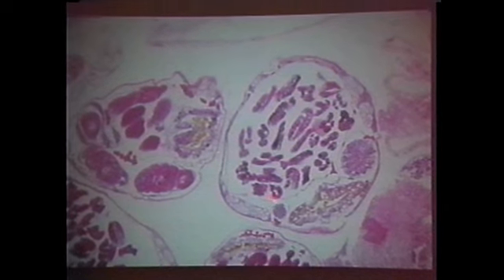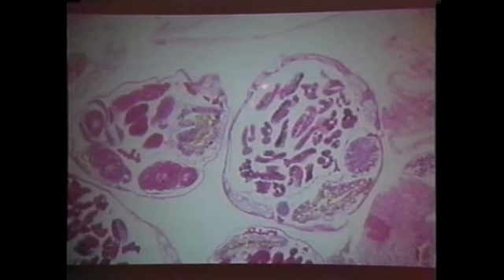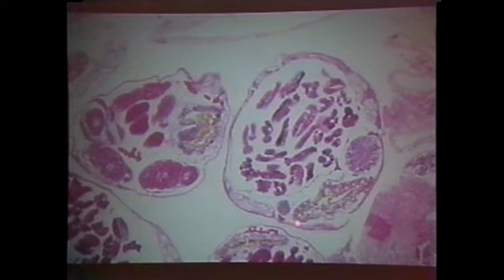This is Rhabdias, which commonly occurs in snakes and in amphibian lungs, larvae within the female. And notice, it has pushed the muscle so much. These are the lateral cords. You can hardly tell anything about the muscles. All right? But here, these are ova. They're later going to make the larvae. And that's how you can tell Rhabdias.